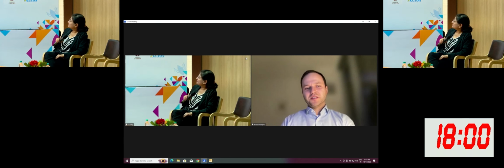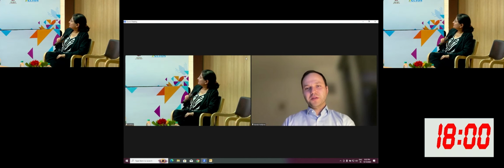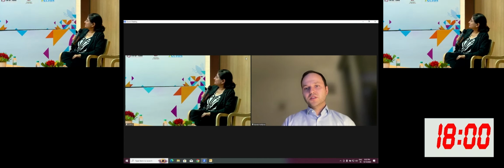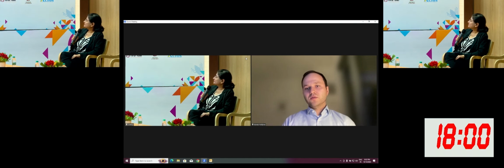I totally agree, and at the end of the day, if you have a symptomatic patient who has aortic stenosis, you need to treat that, right? So it really doesn't matter if it's 0.8 or 1 square centimeter. The calcifications are really more important, the symmetry of the calcifications. For example, bulkiness is more important than the number itself, just to really decide on what valve you are going to take. You saw all the different valves. For example, the CoreValve, which is self-expandable, doesn't have so much force to actually push the calcification to the sides, and we know that this valve leads more frequently to paravalvular leakage than, for example, the Sapien 3, which even has this sealing ring around it.